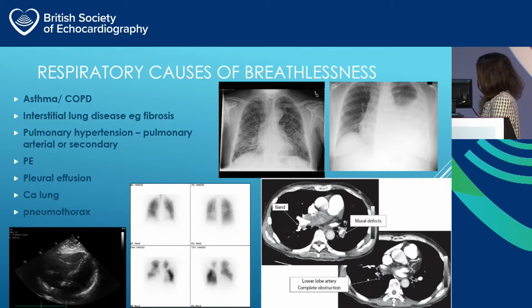And the CT scan on the lower right shows truncation of the pulmonary arteries. I've got a pointer here. There you go, they stop dead. You've also got a defect here where you've got an obstruction, and here, and this is chronic thromboembolic pulmonary disease.